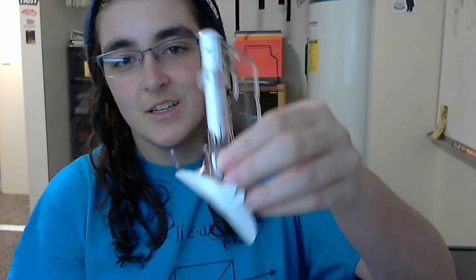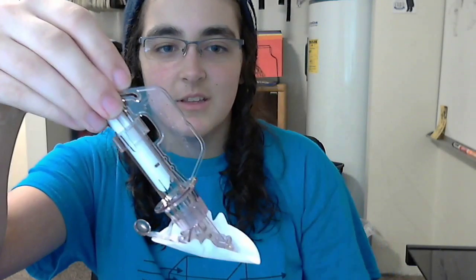So to start off, I'm going to take out my awesome Dexcom sensor here. And so there's a little sensor needle that will come down with the needle. I'll remove the needle. Thankfully, I don't want that thing in my arm all the time. To start off, I'll remove the 2 adhesive pieces.